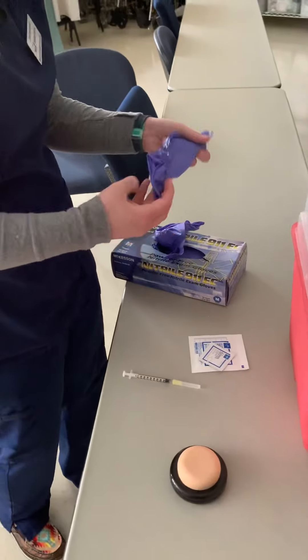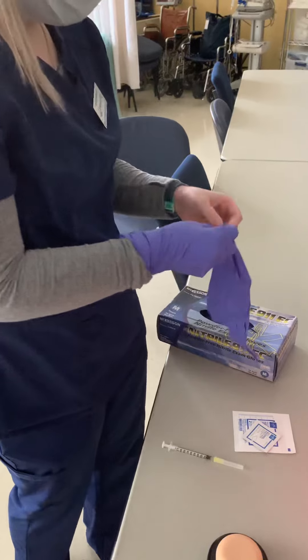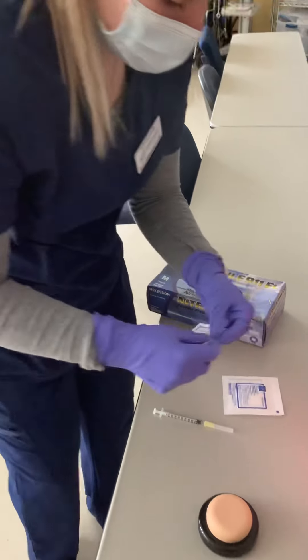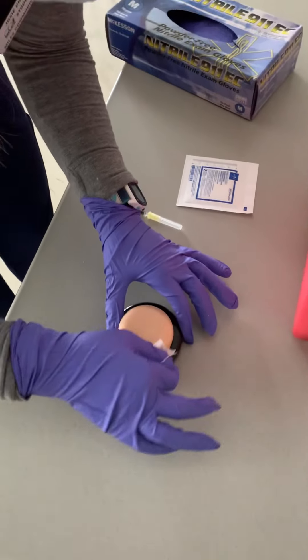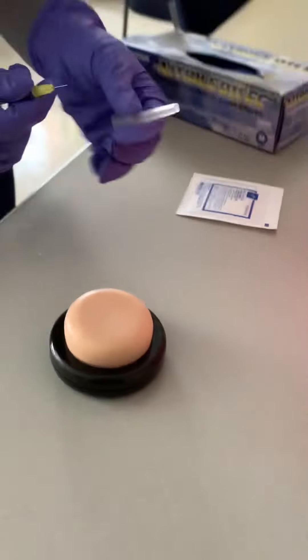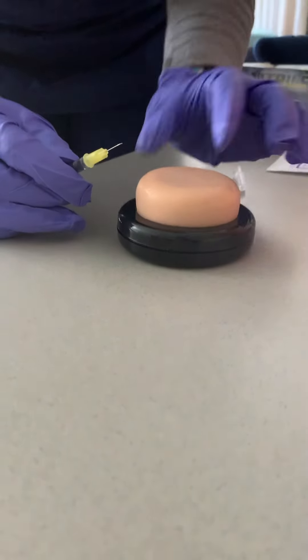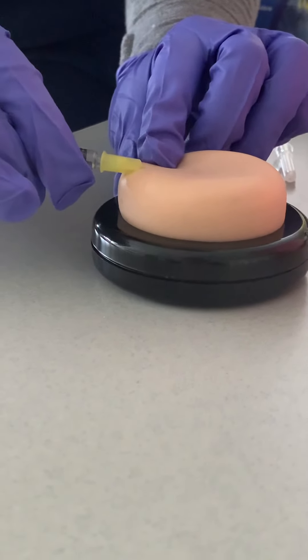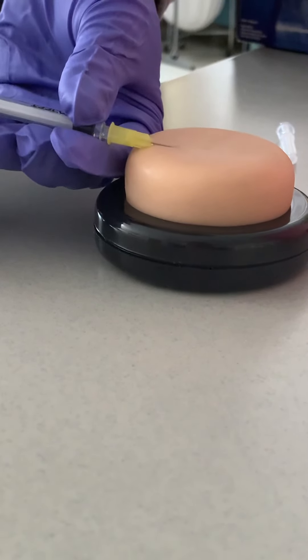I'll glove up and clean the area, then discard my alcohol swab. I'll uncap the needle and insert it bevel up. After allowing the alcohol to dry, I'll pull the patient's skin taut, insert the needle at a five-degree angle about an eighth of an inch, and inject the medication.